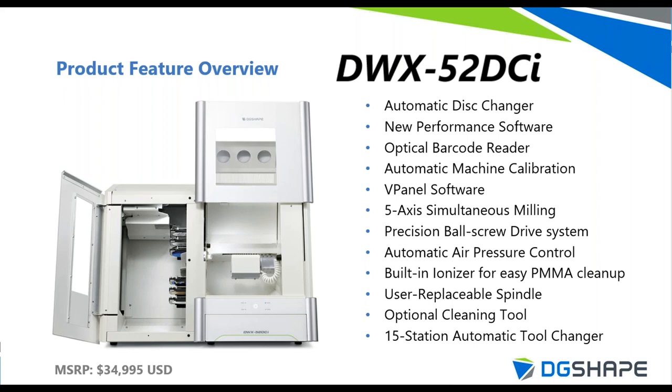Moving on to the flagship DWX-52DCI — the ultimate in unattended production. This machine holds six pucks at one time, swaps them out automatically, and chooses the proper tool for each job. It features automatic tool change and automatic disc change. We also offer a free Performance software downloadable from our website that monitors material usage, tool life, and mill utilization frequency, and generates reports to help with maintenance scheduling and inventory ordering.